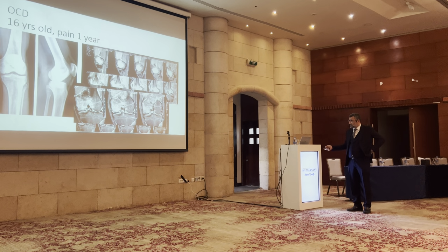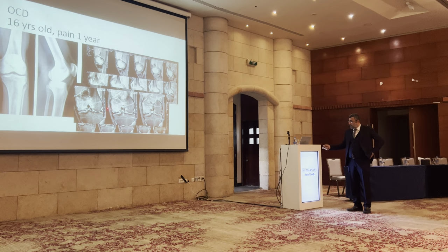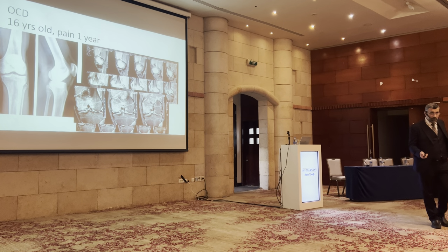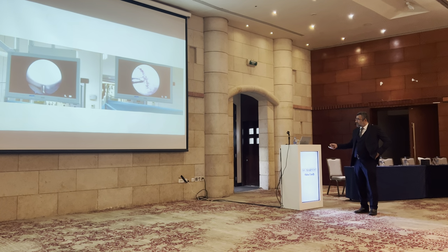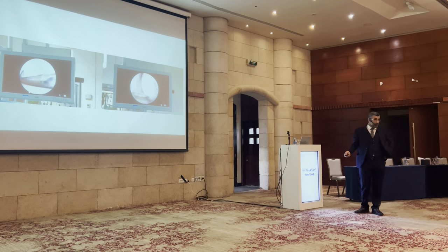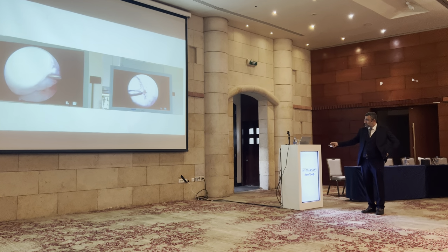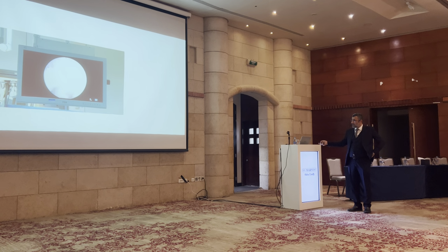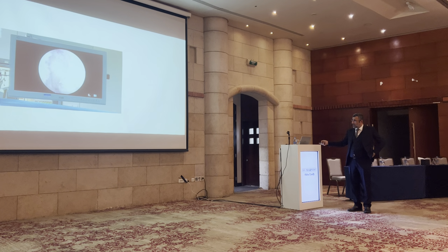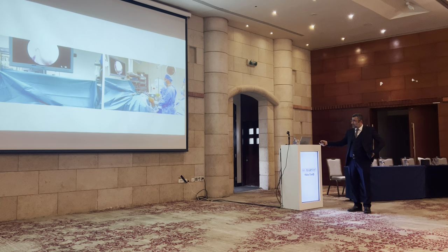So this is another case of osteochondritis dissecans, where in the MRI there is fluid behind the subchondral bone, but still the subchondral bone is good. So what to do? To do autograft or to do fixation? We tried with the fixation because, you see here, there was good bone in the fragment. So we did refresh, realign, and you see how large the lesion is. And then refreshment using, again, a curette, and using again a shaver for the membrane, and microfracture. And then, after that, fixation by wire.